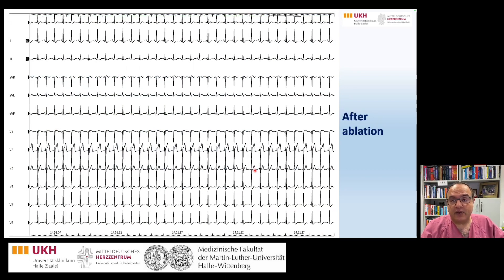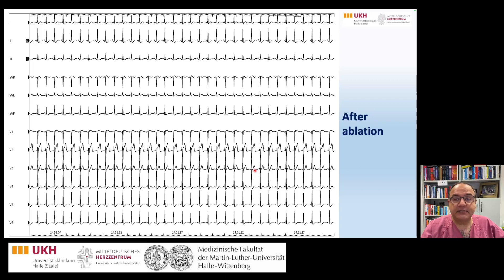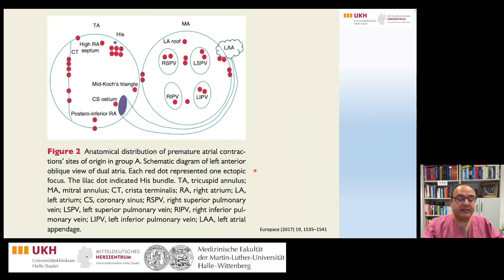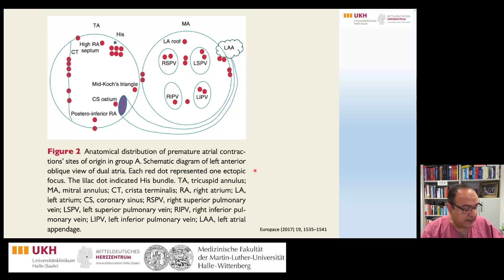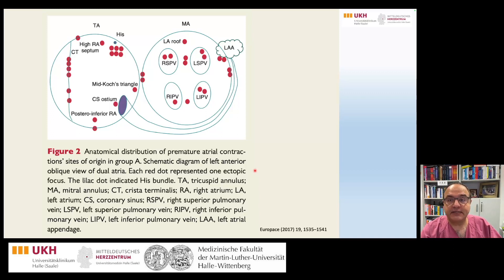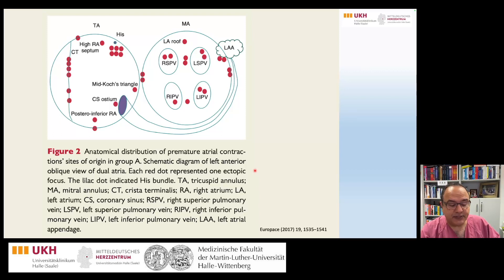During the short follow-up after this ablation over the last three months, the patient remained asymptomatic. There is an interesting article published in 2017 comparing 35 patients with PAC alone and 35 patients with PAC and atrial fibrillation.